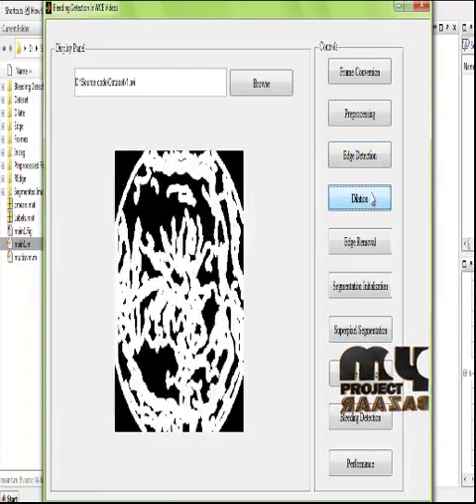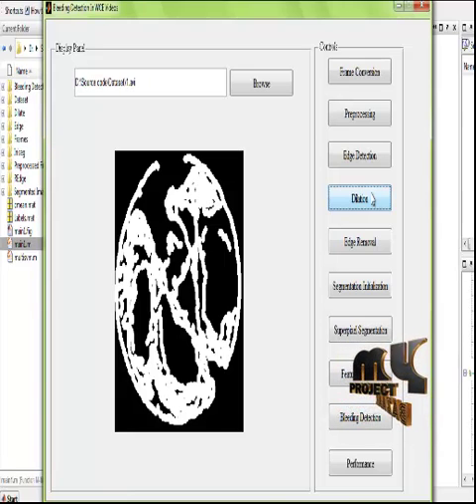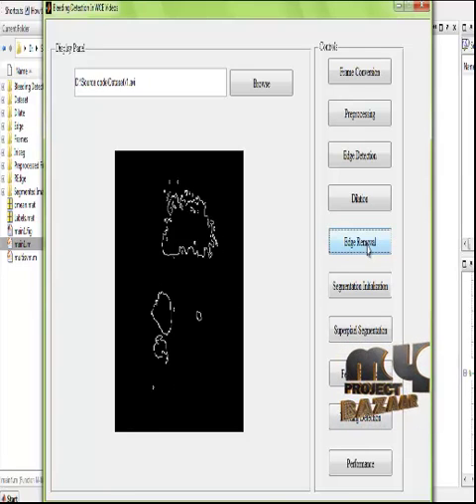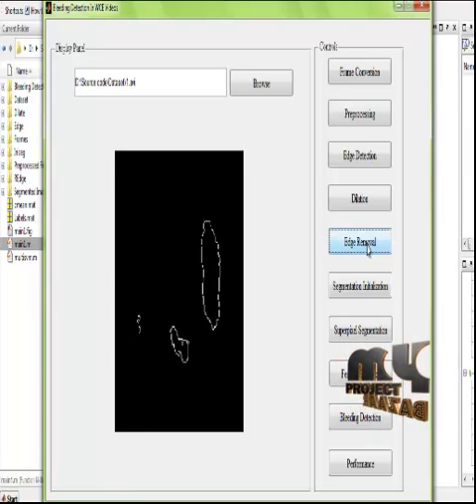Then the dilation process is employed. In dilation, the regions selected in the previous edge detection are well identified, and the overall identified regions are increased. This helps in searching the complete video frames for the detection of portions in the frames. After that comes the edge removal process. In the edge removal process, the input frames are compared with the detected edge regions in order to identify the final edge pixels recognized in the images.